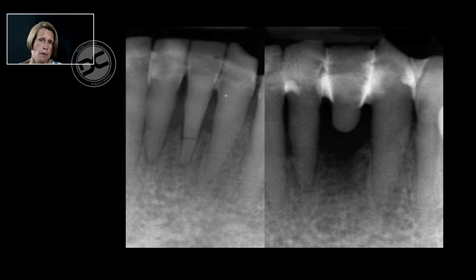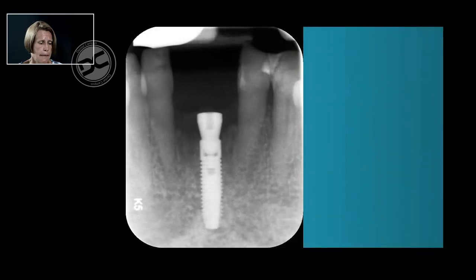Another example where you can discuss the issue and use of cone beam CT is the present one. This patient got a fracture, the tooth was splinted, and afterwards an implant placement was planned. But when the implant was placed, the patient had a real neuropathic complaint. And so action was taken and a cone beam was made afterwards to check the real problem.